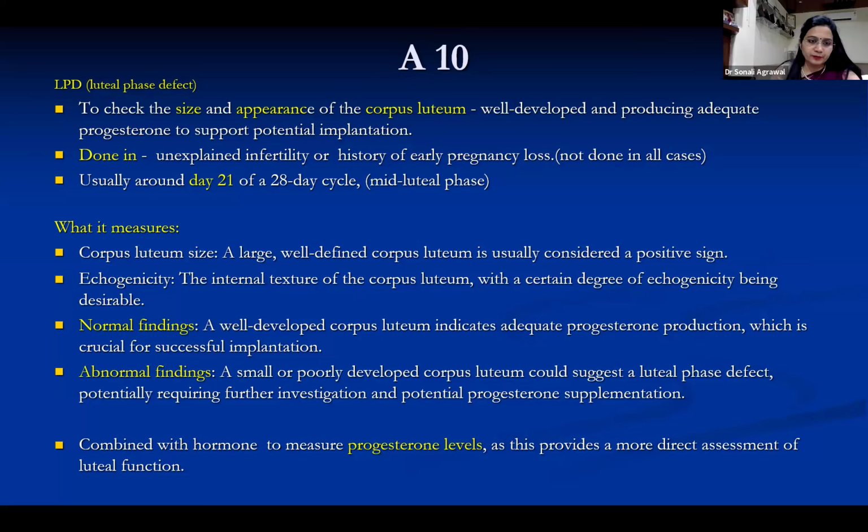When the corpus luteum size is large and well-defined, it is usually considered a positive sign. When the echogenicity, internal texture and vascularity of the corpus luteum are good, then it is considered normal. A well-defined corpus luteum indicates adequate progesterone production, which is crucial for successful implantation.